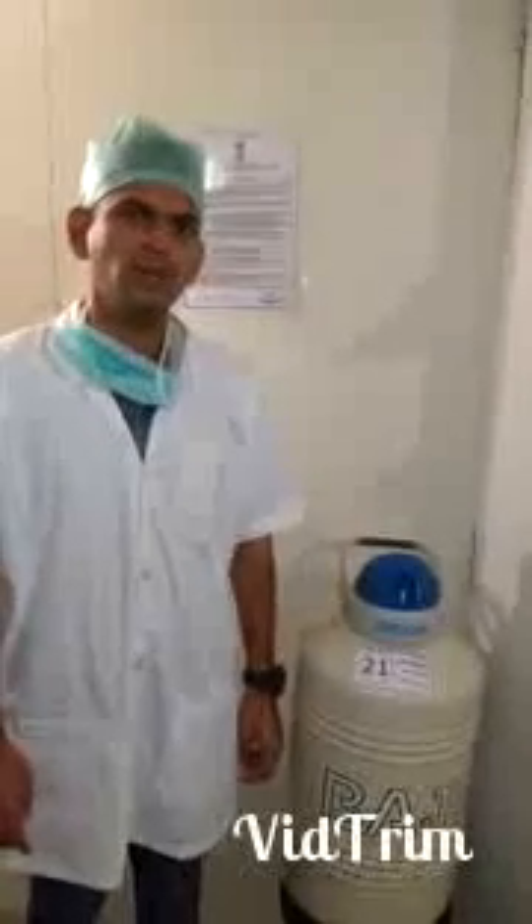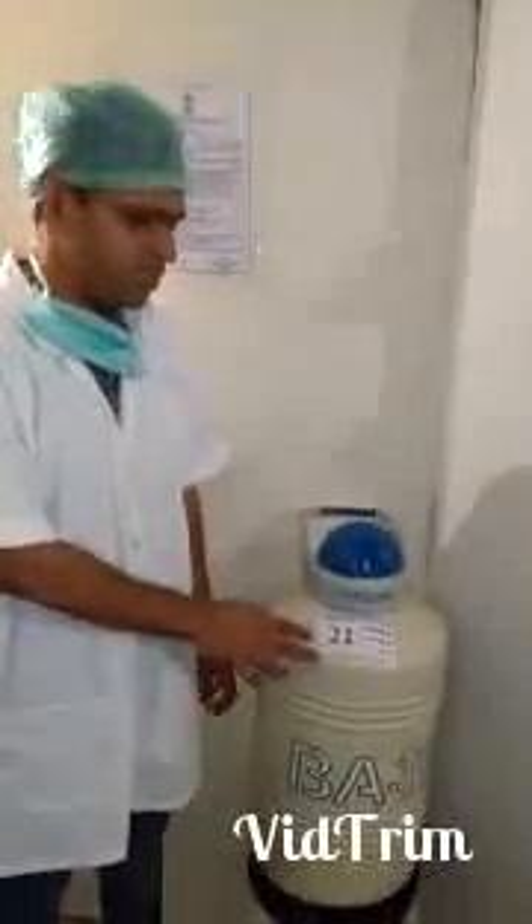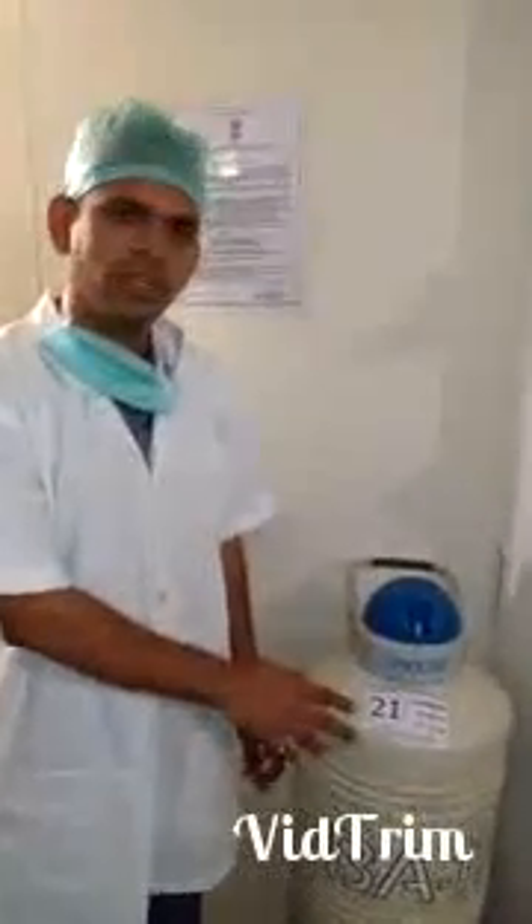Hello, in today's video I am going to give you an idea about cryocans. Cryocans are basically liquid nitrogen containers in which we preserve frozen embryos, eggs and sperms.